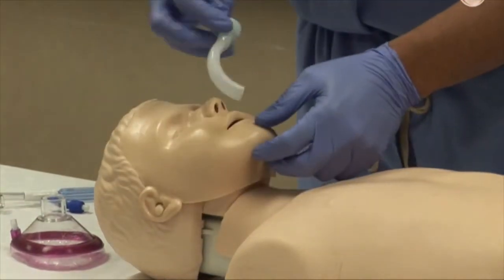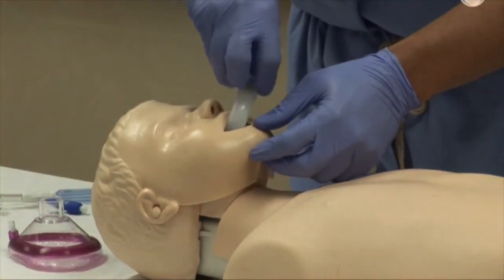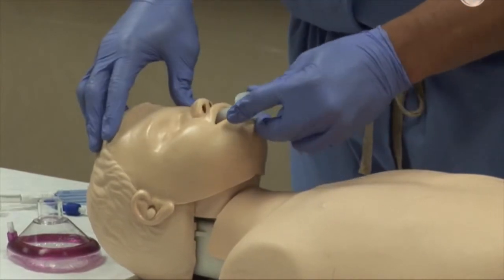Insertion is achieved by pointing the tip toward the hard palate then rotating 180 degrees until the tip reaches the posterior pharyngeal wall.